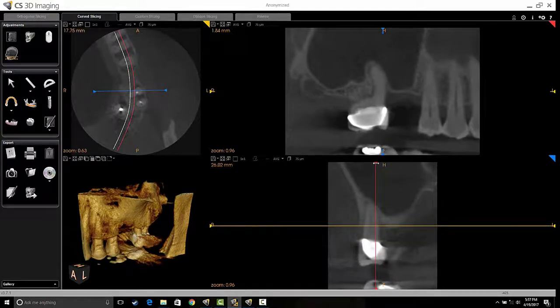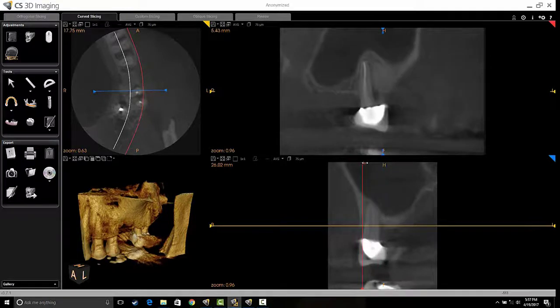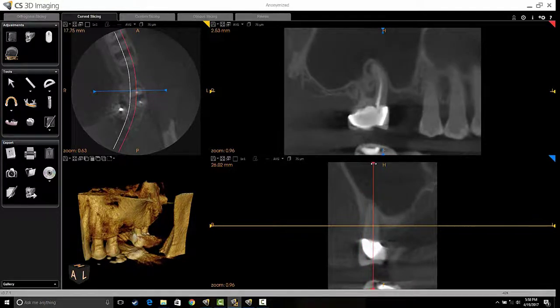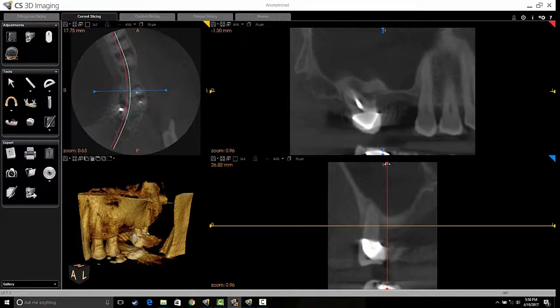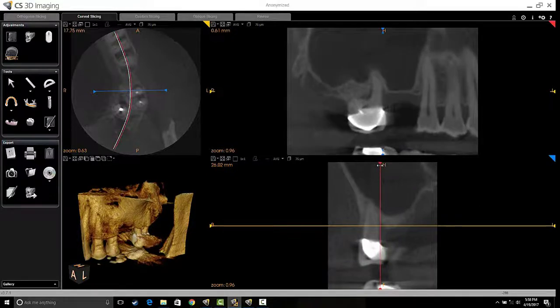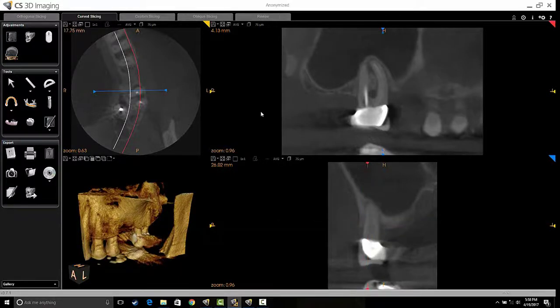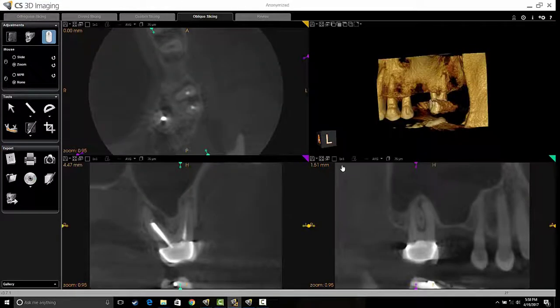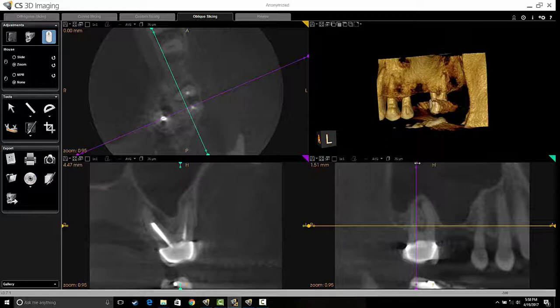In curved slicing, I'm moving the scan from the buccal all the way to the palatal, looking at the premolar region and the region of the sinus. Once satisfied, I focus on the region of interest — tooth number 15 — and go into the oblique slice mode, which allows me as an endodontist to align the slices along the long axis of the root I am studying in greater detail.